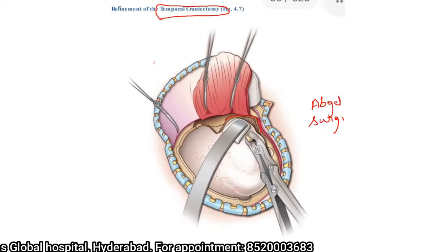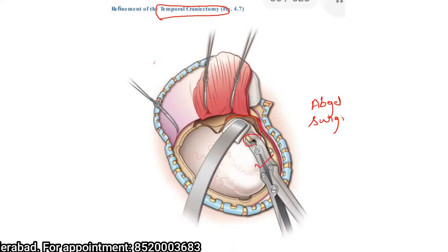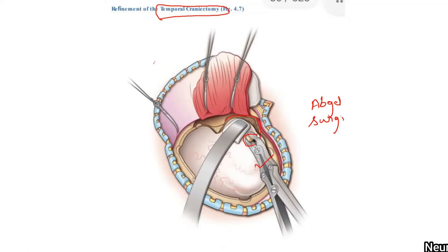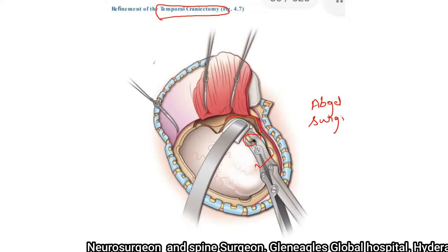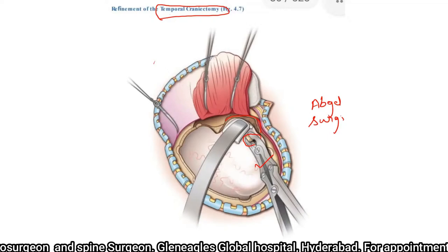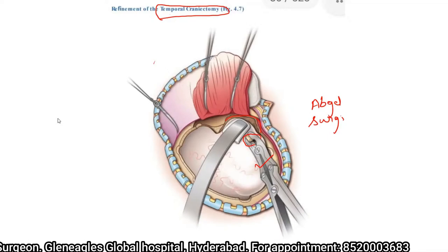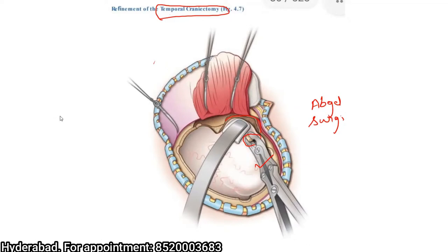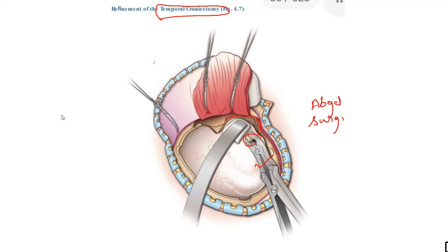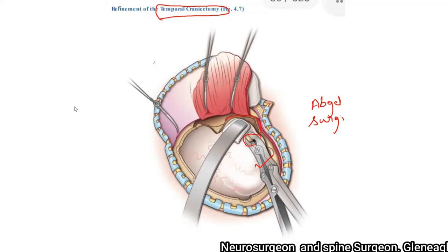Once this is done, you can use a Nibbler to rongeur the bone to reach the base of the middle cranial fossa. If any air cells are opened, close them with Avitene and bone wax. The squamous portion of the temporal bone must be removed until flush with the floor of the middle cranial fossa. If the mastoid air cells are exposed, bone wax should be applied completely so that there is no CSF leak later on.